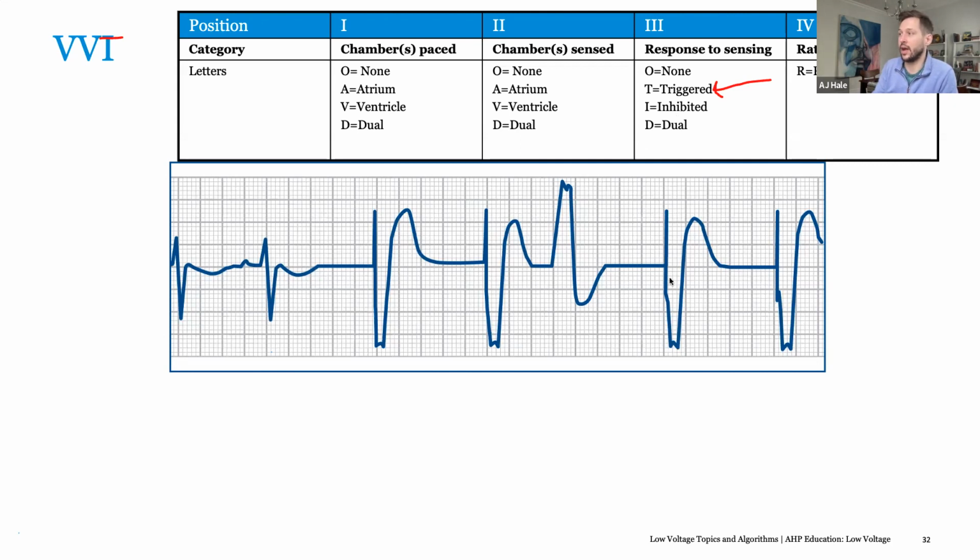But yeah, I think those are all really good points. What you could do, I don't know if you have access to echo, but you could assess cardiac output under pacing at a higher rate versus under their intrinsic. And if their intrinsic is really that terrible, then I think you're better off pacing at a higher rate. But I'm not a physician either, and you need to take those conversations with physicians, which I'm happy to connect you with. But you can use additional clinical tools you may have in your toolbox to assess those things.